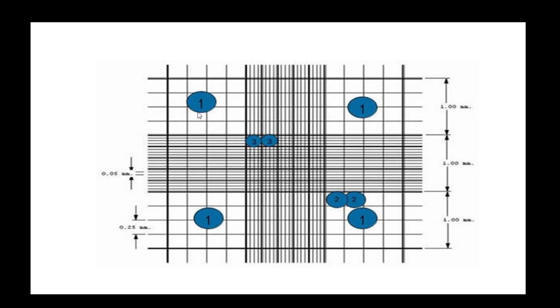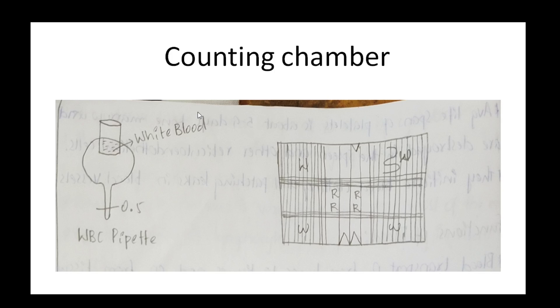Under the microscope, the chamber should be clearly visible. We place the counting chamber under the microscope and make sure it is clearly positioned for counting.